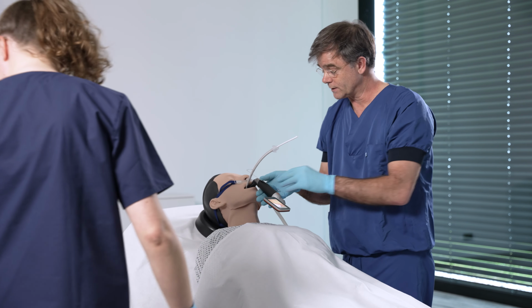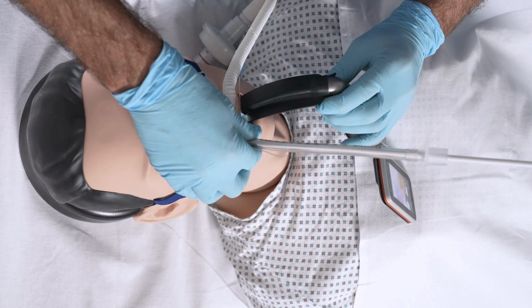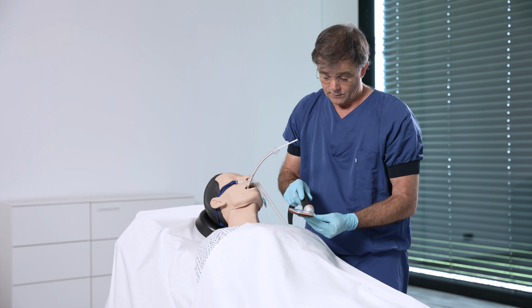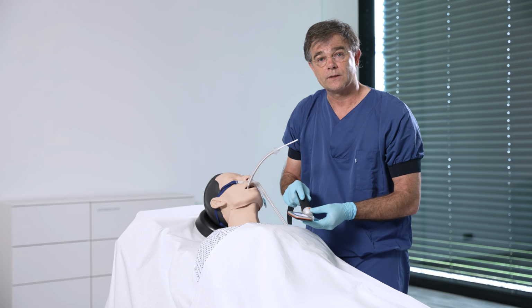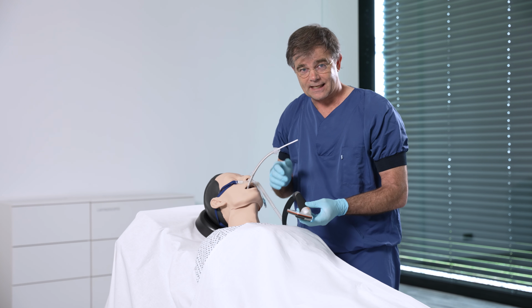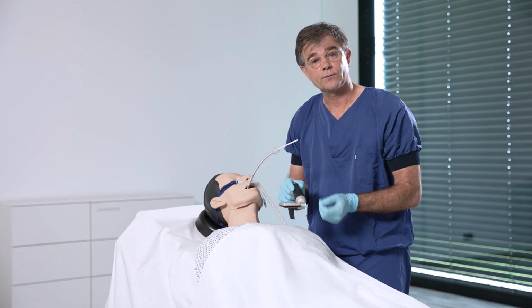So we do this in the hospital face to face because patients cannot lie flat. But if you work in the pre-hospital setting, for example with HEMS teams, helicopter teams, or I work in air ambulance, we sometimes don't have access to the head of the patient. And this is an excellent technique to be able to intubate patients face to face.